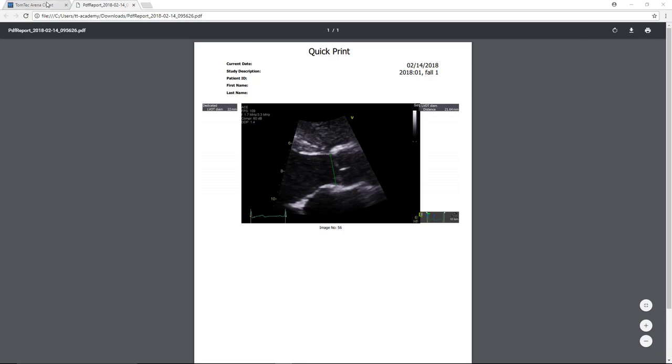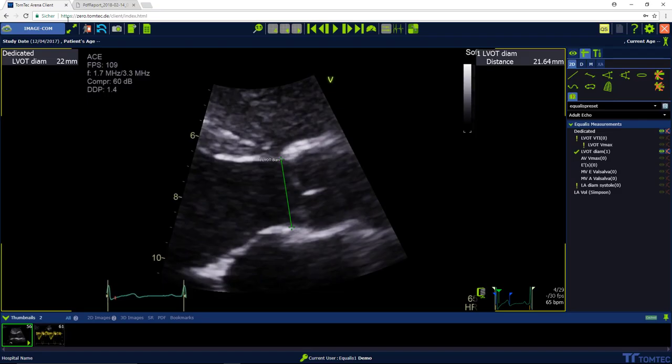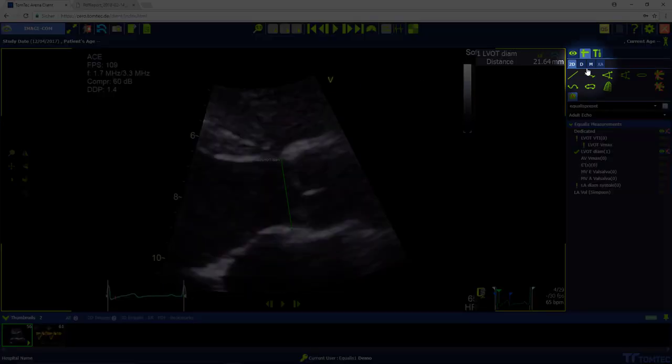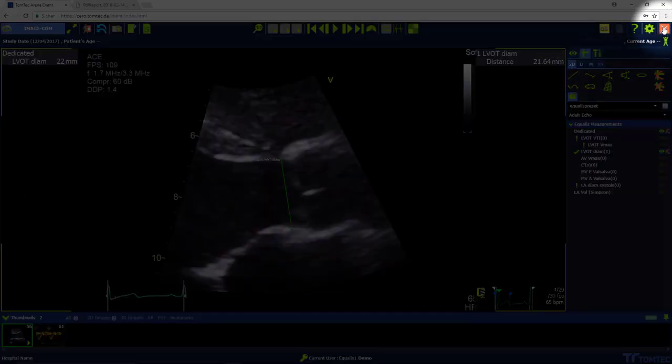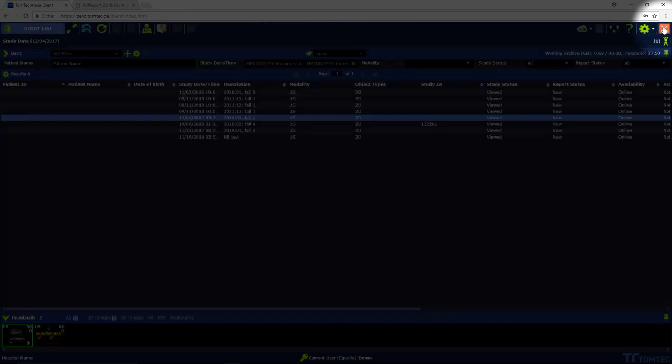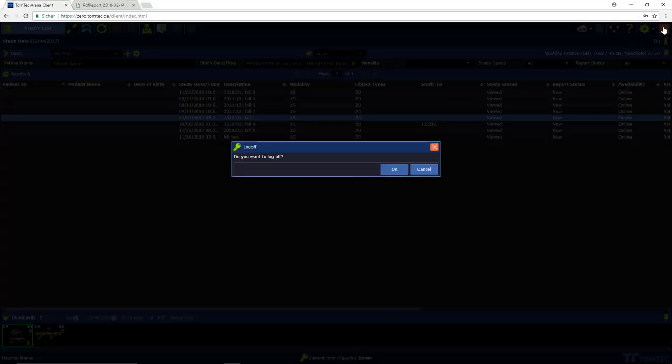After you've finished, you can exit the application by selecting the button Close Image Com. To log off, press Exit.